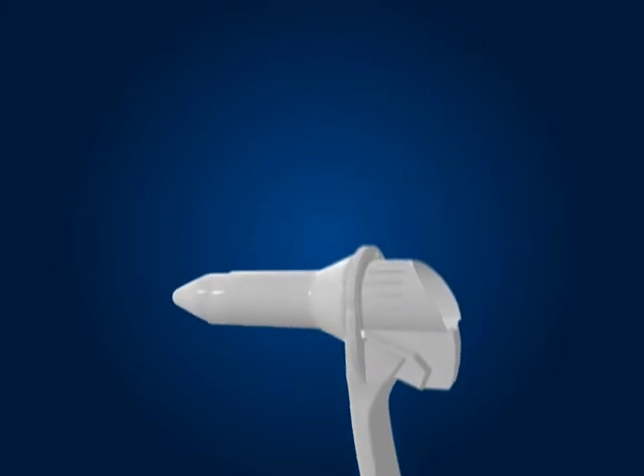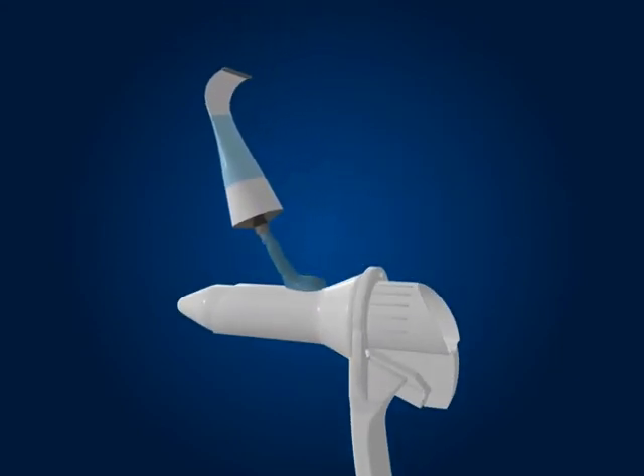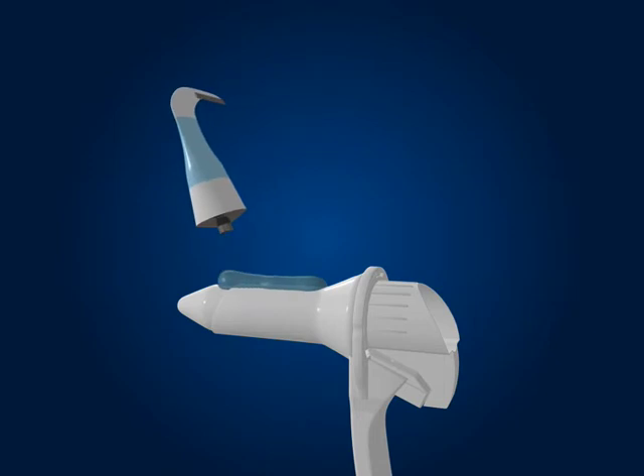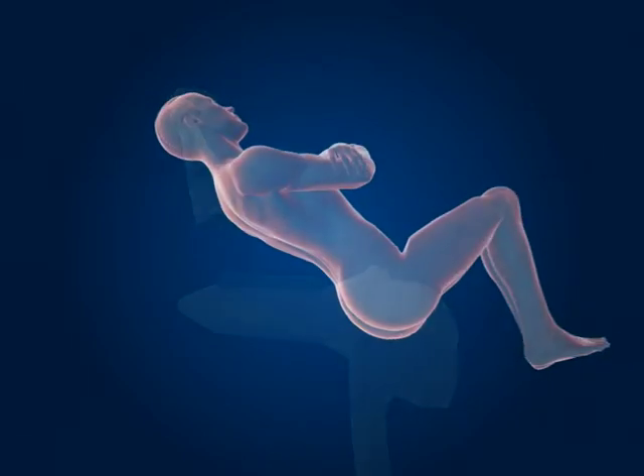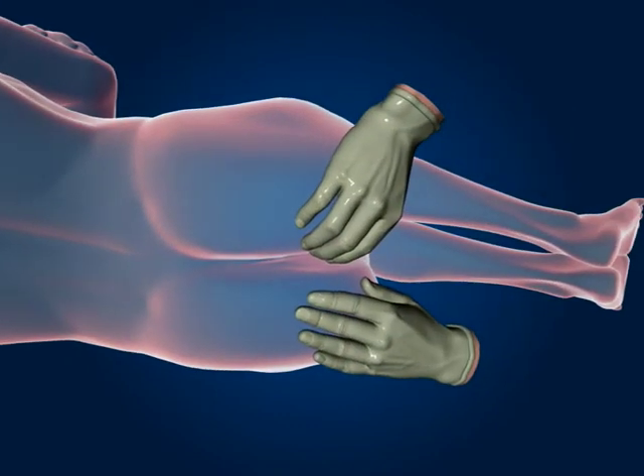Using a sterile water-based lubricant, lubricate the exterior of the device and the rectal area. Before introducing the instrument, perform a rectal examination to check for any tender areas.